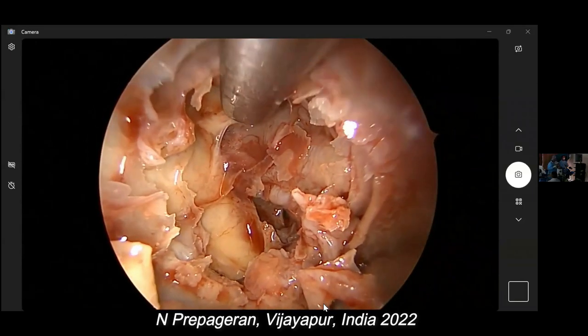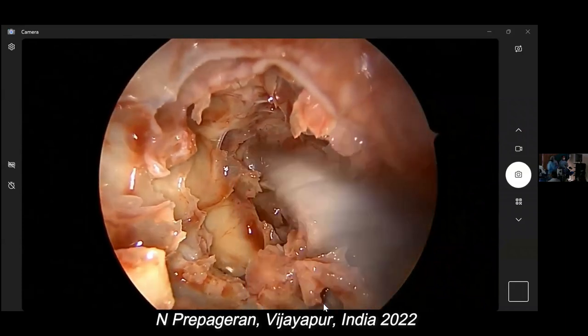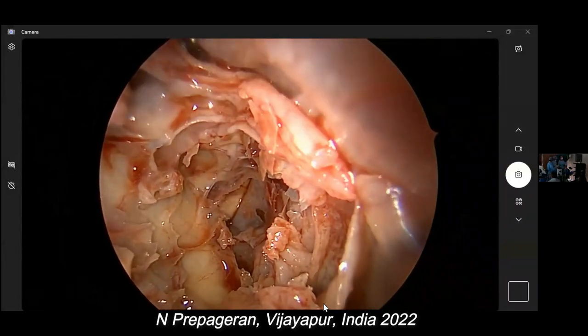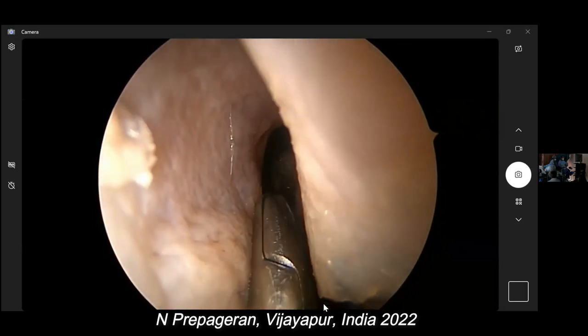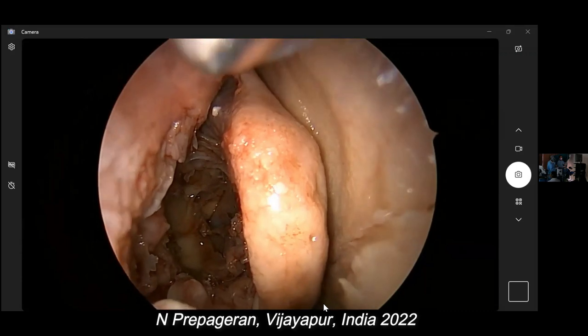Let me remove all this bone. That might be the posterior ethmoidal artery. Anterior might be here. Blakesley again. Now I'm going to put the scope on the floor of the nose and look up.